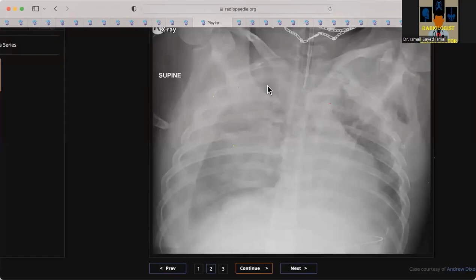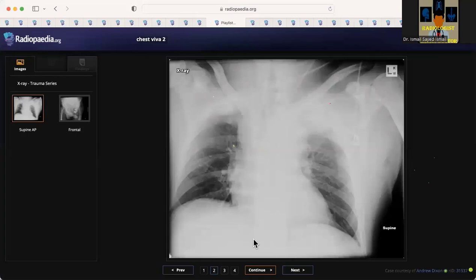So we've mentioned one of them, which is a traumatic aortic injury. Other causes, it could be like a mediastinal hematoma. It could be secondary to the rib fractures. So I think the next case here, yeah. So who's next? So that's just a companion case with the previous one, and then we can have a break here.